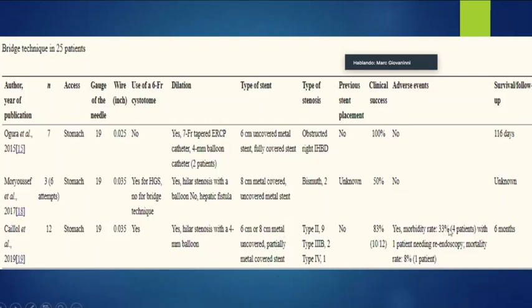You see in our paper that the morbidity rate is quite high, 4 patients out of 12, but these complications were managed medically. Only one patient needed to be re-endoscoped for bleeding, and you see one patient died in this study after the procedure. But you see that it was mainly type 2, but also some more advanced hilar cancer.